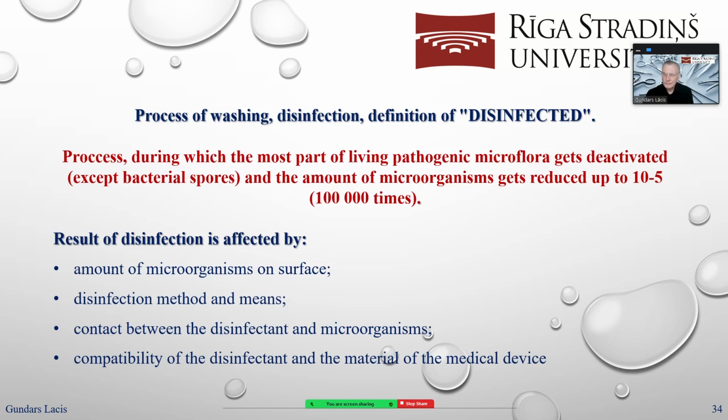Disinfection process, when we are inactivating pathogenic microflora up to the amount of 100,000 times, is called disinfection. The result of disinfection is affected by the amount of microorganisms on the surface.